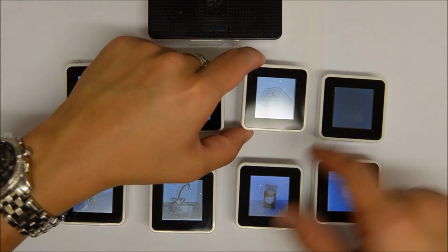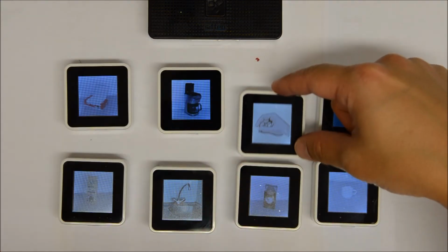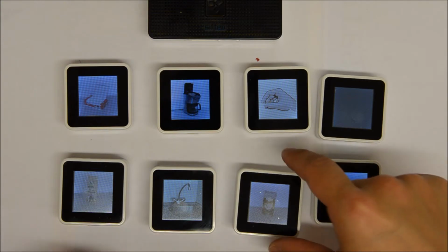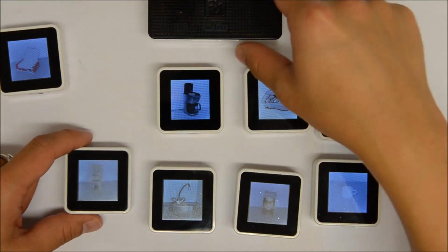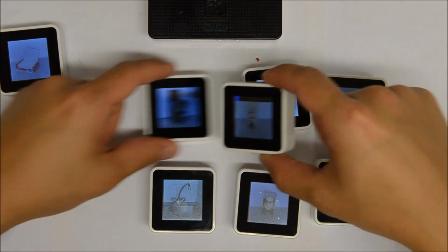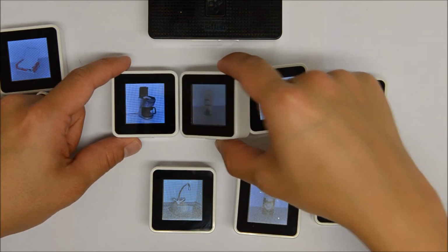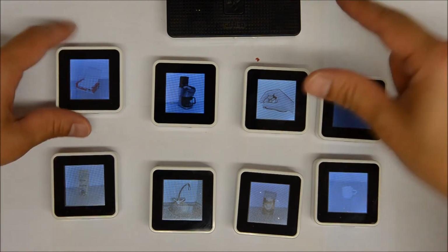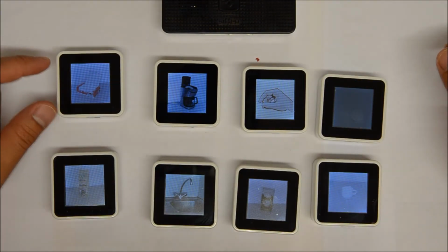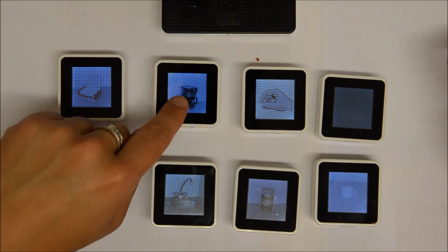Now we put the filter in. Now put that to the screen. Of course, you can lift up the cubes at any time. I'm just keeping it on the ground for focusing purposes. Close that. And there's also a touching and holding action as well.